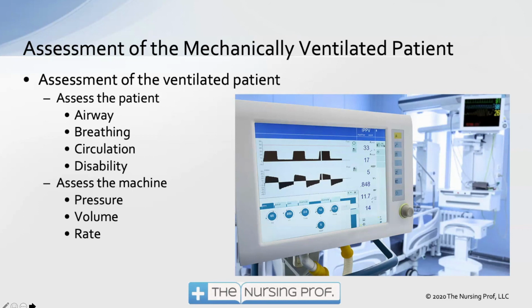In the meantime, though, let's look at the patient. Check the airway. Is the airway intact? Does the ventilator maybe become disconnected? Are there secretions in the airway? Does the patient need to be suctioned? All those kind of things. Look at the patient's breathing. How are they breathing? Maybe the sedation is not adequate, or the patient is waking up, or they're anxious, or any of those kind of things. Look at their circulation. What are their vital signs like? Is there a problem? Are they starting to crash? Maybe that's part of the issue as well. And look at disability. Whether or not that patient is going to be able to wean from the ventilator, and how well that patient is moving around in bed, and those kind of things.